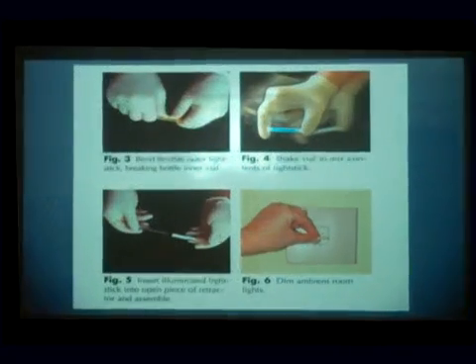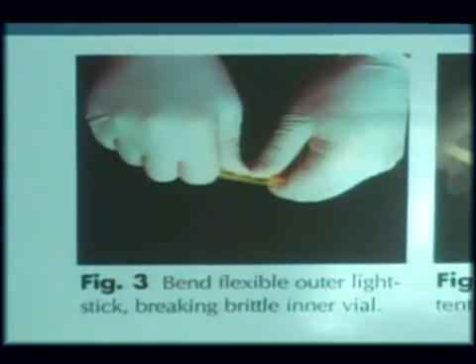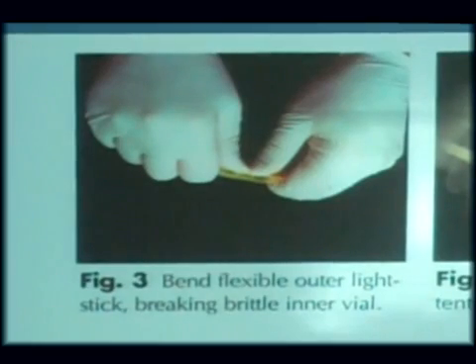And initially this was a chemoluminescence, a little tube of chemicals. You bend it a little bit and break a little glass barrier, and the two chemicals, you shake them up, and you get light. Let there be light. We've all seen this now at carnivals and things like that. The kids use them for Halloween. And depending on what chemicals you use, you can get just the right wavelength. And this is the blue wavelength.